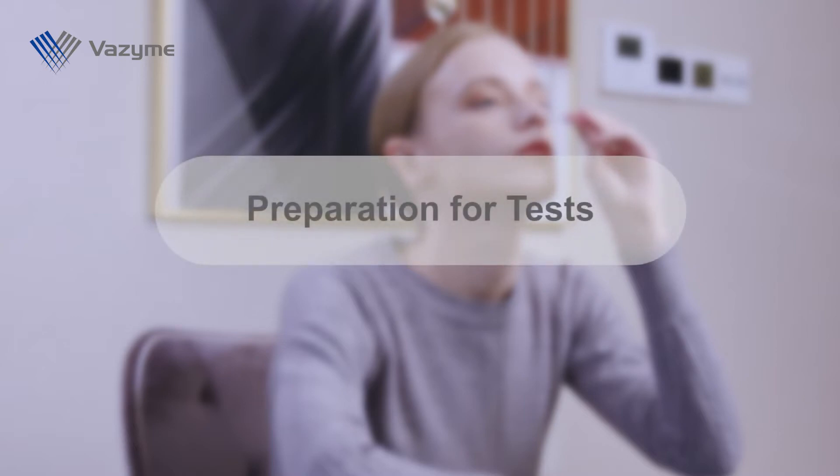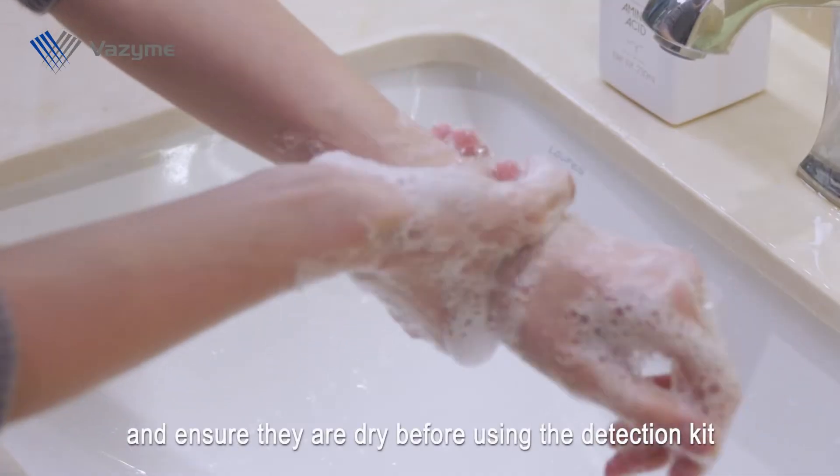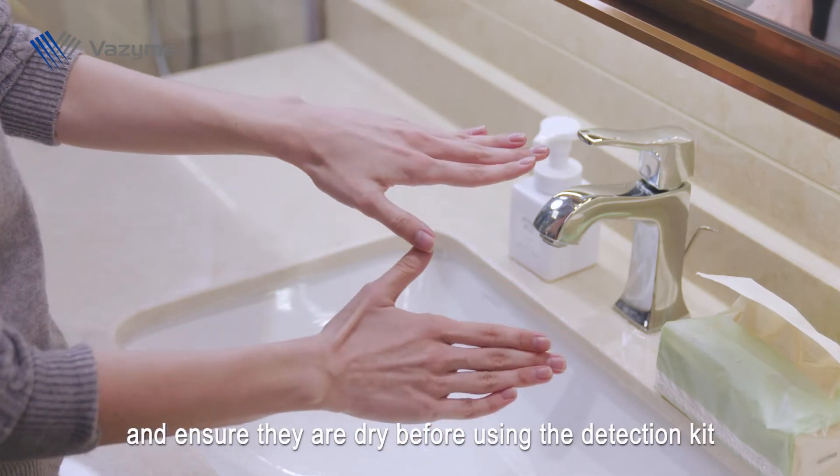Preparation for test. Please wash your hands and ensure they are dry before using the detection kit.